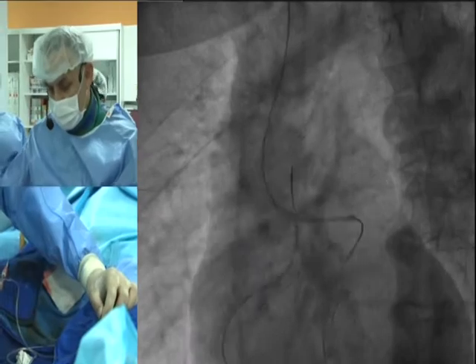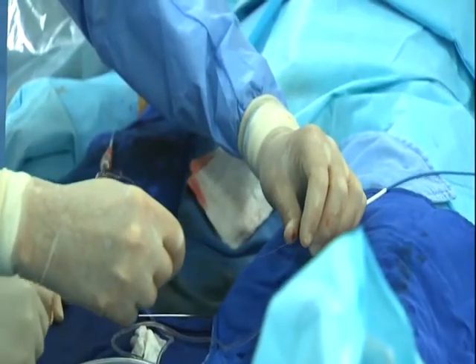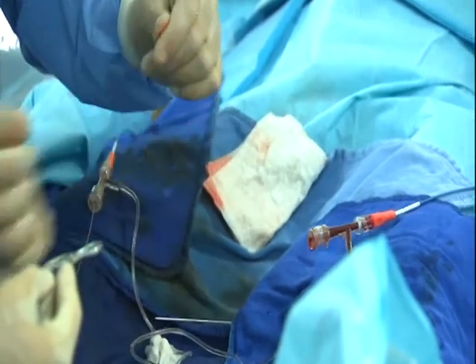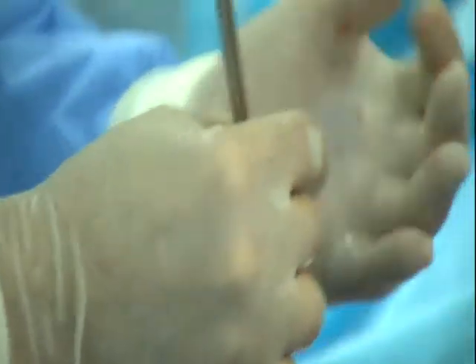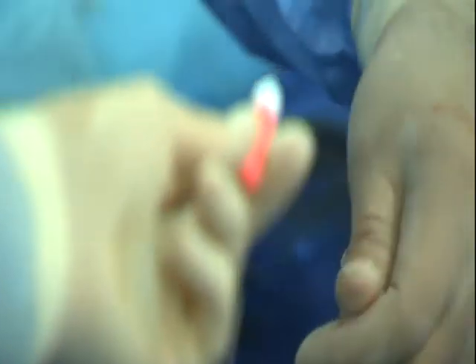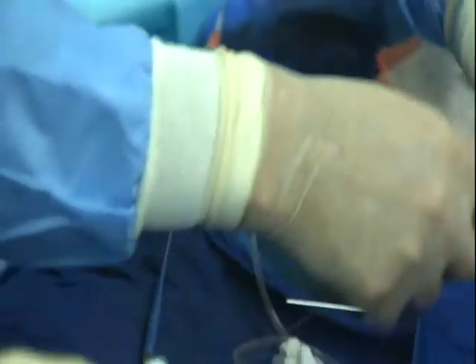Can I have scissors? So now, you see, because I snared the wire, I have this ugly shape. It's better to cut this one. Okay, now I have the loop wire with my hand, two hands.